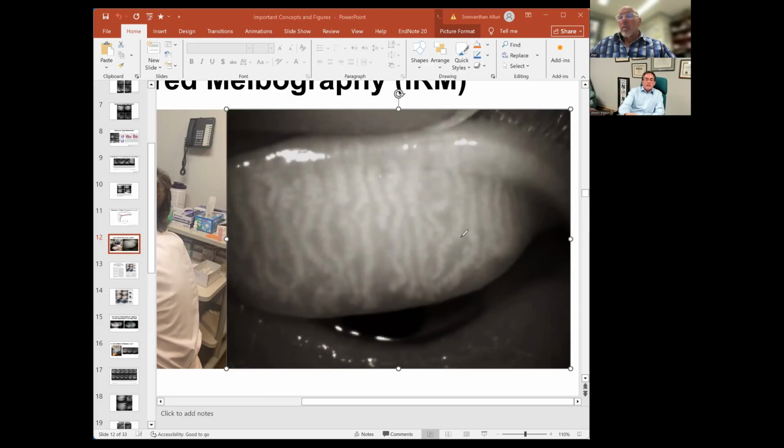And then we can go to the left, like a fourth or fifth gland in from the left. So there's a number of abnormalities here, all showing atrophic change. Sometimes we just see a little cyst forming, which is an early change.